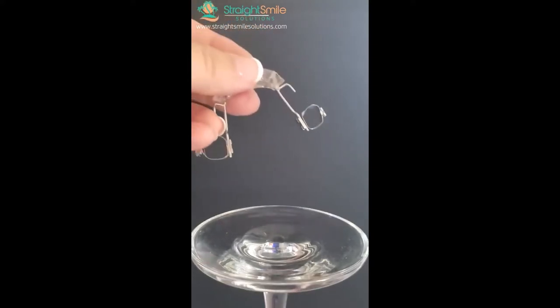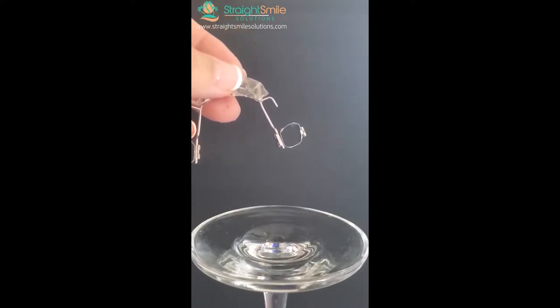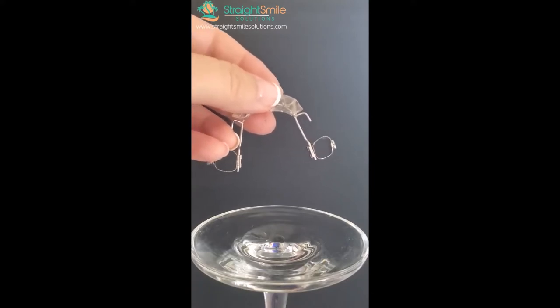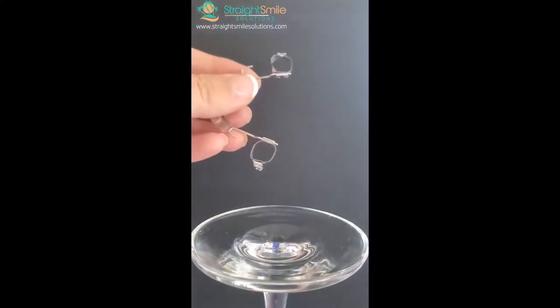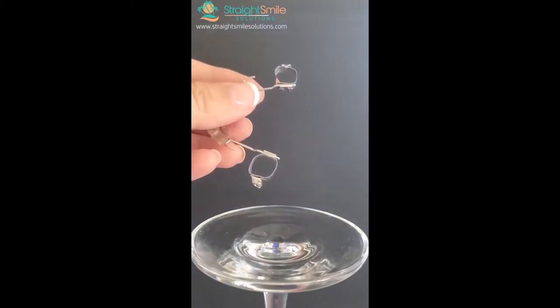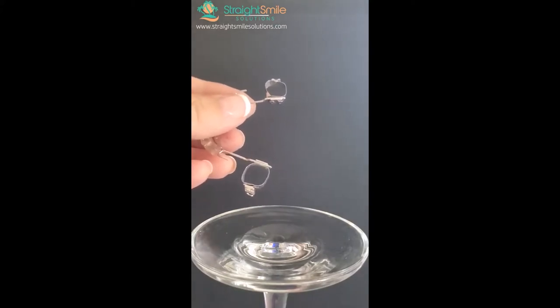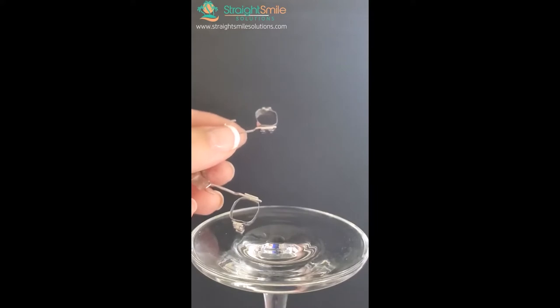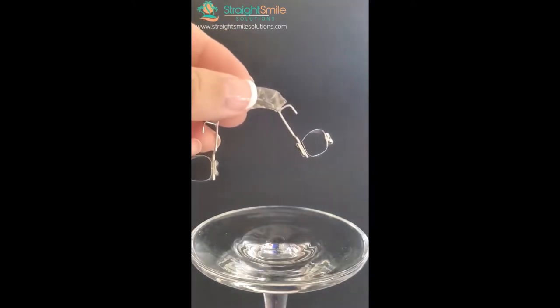If you're going on to do brackets, ask the lab to solder buccal tubes on the bands. For phase one bite correction only, you don't need the tube soldered on. The removable version looks like a retainer, so it's compliance-based — pick your patient wisely. I recommend throwing spacers in first, then taking them out before taking the impression so the bands fit better. If you have bands in stock you can fit them first and do a pickup impression.